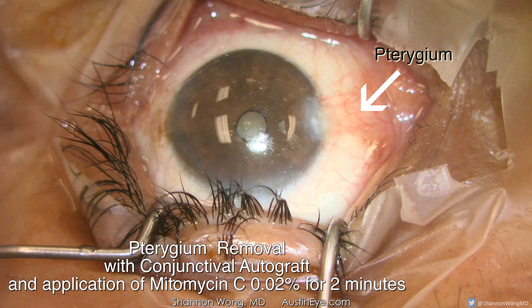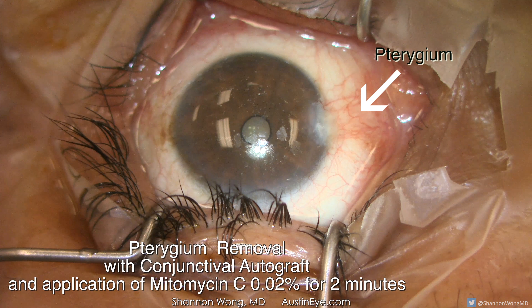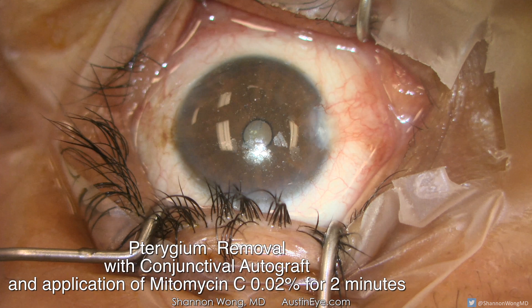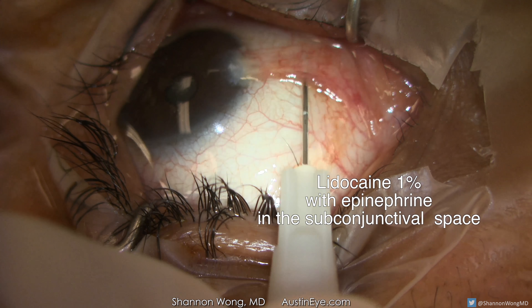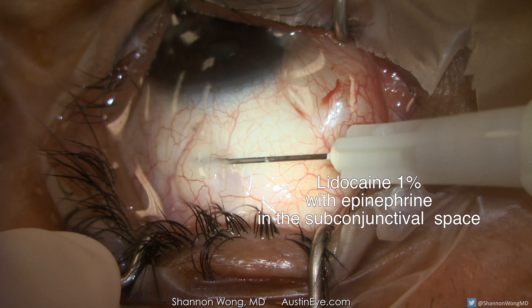My personal technique involves application of local anesthesia — lidocaine eye drops — followed by placement of subconjunctival lidocaine with epinephrine directly into the pterygium as well as in the area we will use to create the autograft. The patient is awake but comfortable. Most patients are sedated with a Valium tablet. The procedure is painless for the patient.